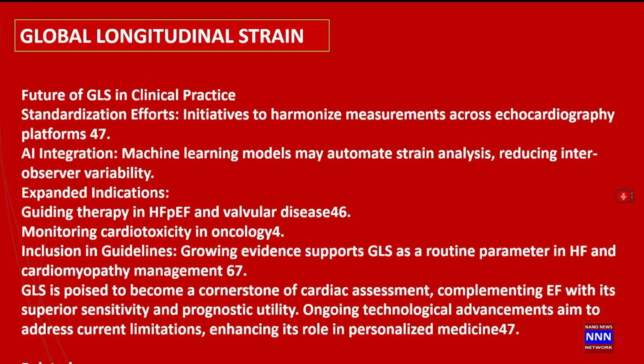So ladies and gentlemen, the future is, of course, to standardize the measurements so that there would be cross-platform uniformity, so that one study done on one machine can be compared with a study done on another machine at a different time. It will help us guide treatment, evaluation and follow-up, and hopefully change the outcomes in the long run.